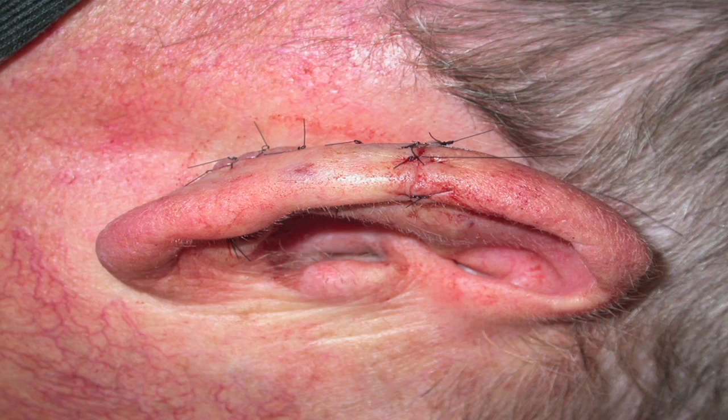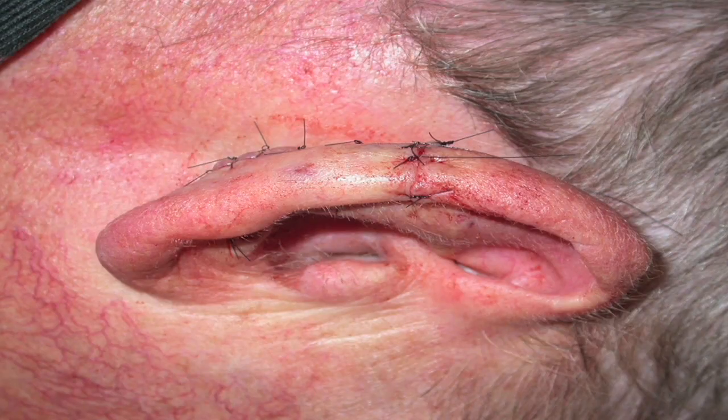Now, one thing with these is as you move things around a convex surface, they tend to dive in when you're joining the two edges together. So convex surfaces can cause some problems in distorting things around it. So often I use a vertical mattress to join the two ends together, just to lift up the skin there to get a better closure.